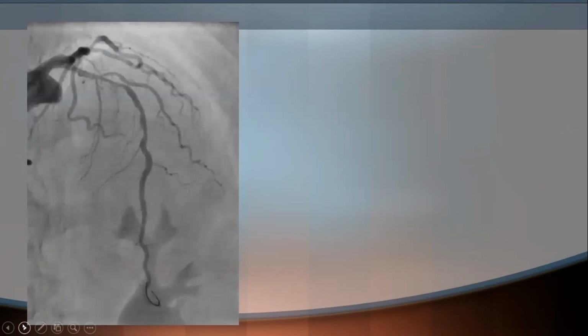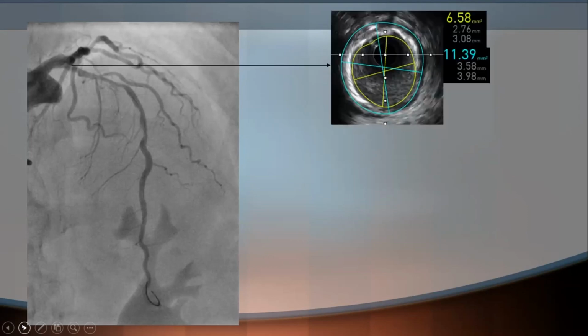So if you look at this, this is a calcified coronary artery that has had a run of rotablation. And now we are going to look at our proximal and distal landing zones and the cracks by the rota. So this is our proximal landing zone, and as you can see, it is a nice zone where we can land our stent without much difficulty.